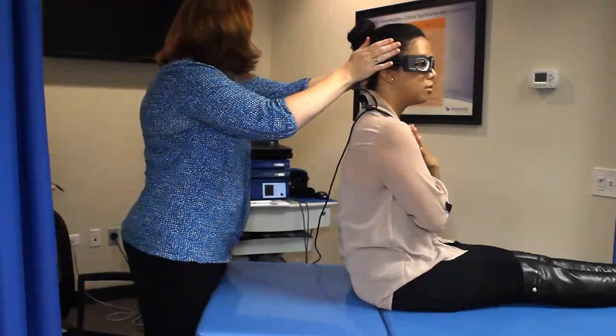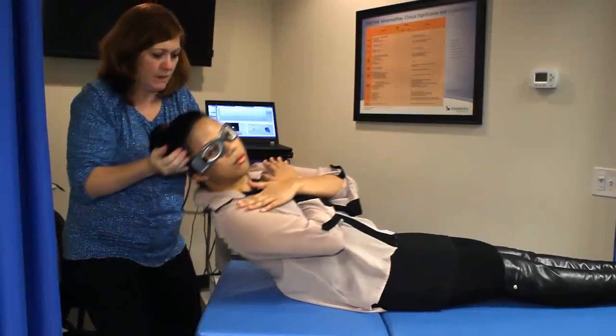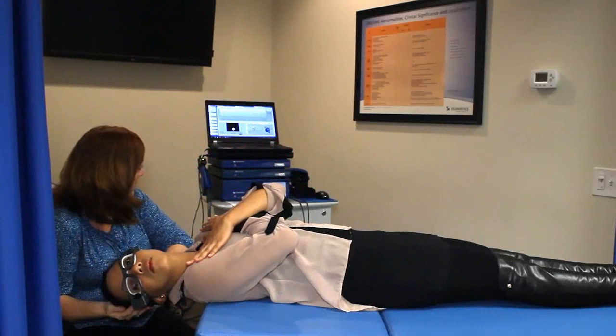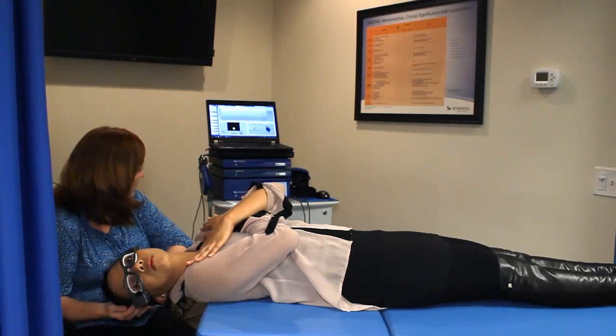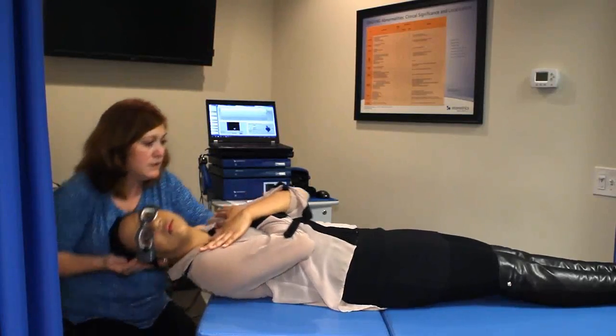So the head is turned 45 degrees to the left or the right, depending on which side is being assessed. The patient is quickly laid back with the head slightly hanging off the end of the exam table. The patient's head is comfortably supported by the examiner during the test. According to the ANSI standard, the eye should be recorded for a minimum of 20 seconds in this position. And it's best to continue recording the eye movement until the nystagmus subsides.